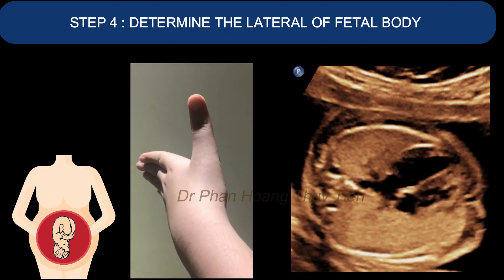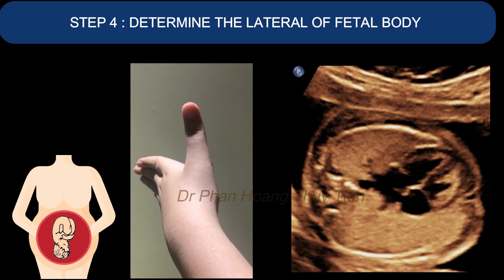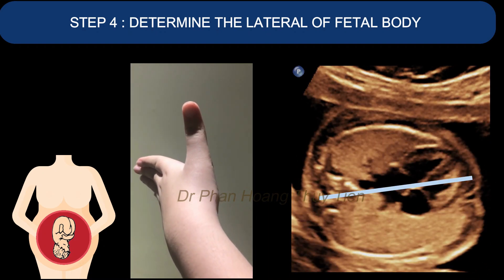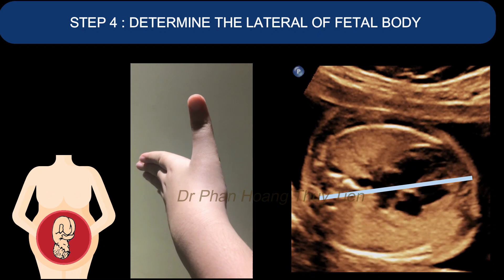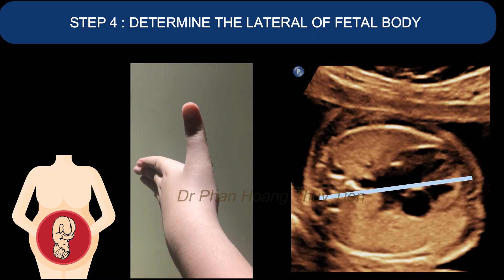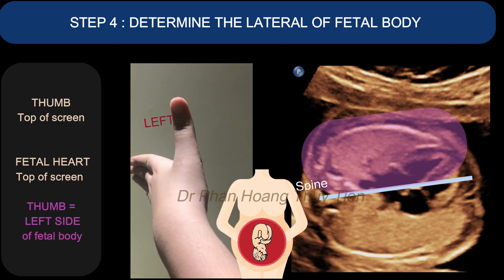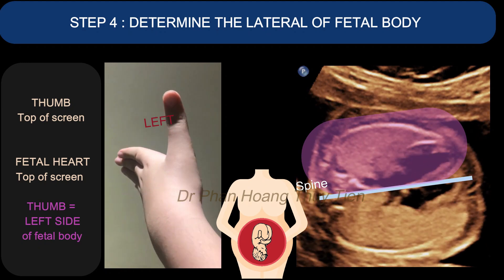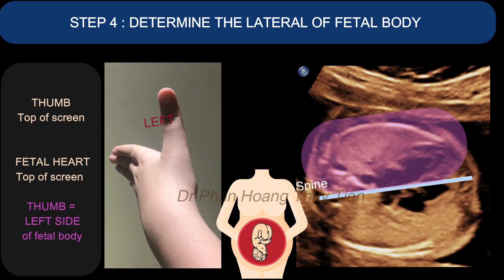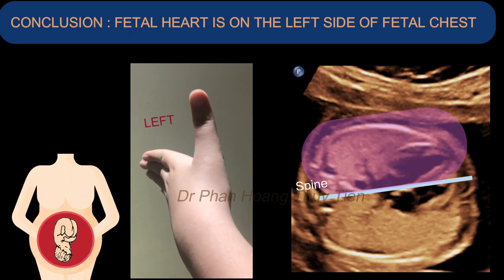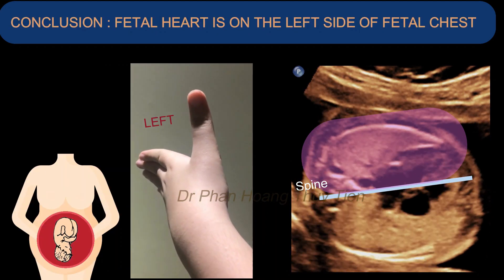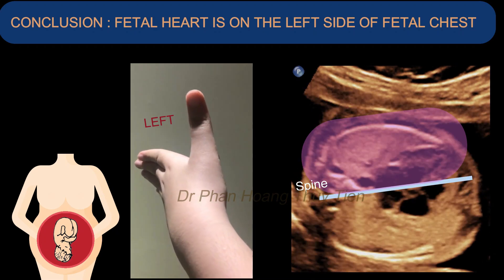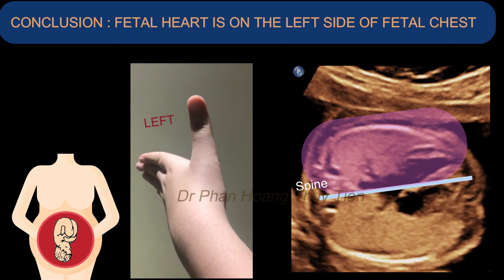Step 4. With the transverse view, you need to create a straight line from the spine that divides the fetal body in half, then apply the technique. You will notice the thumb and heart are positioned accordingly, which leads us to the conclusion that the fetal heart is on the left side of the fetal chest.